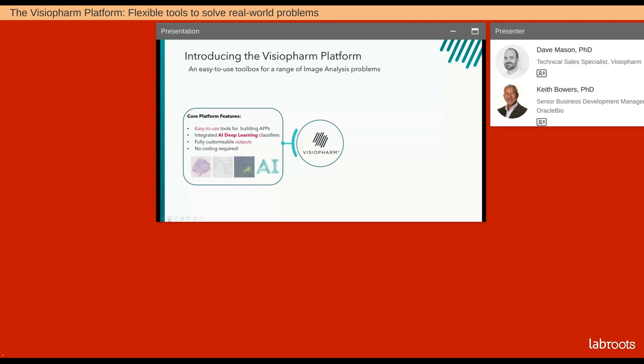It's very important to us that the outputs also be customizable. Every single question you ask of your data will require different metrics. Another pillar that the VisioPharm software is built on is that there'll be no coding required, and this makes it really easy for users to come in and start building apps to solve problems with very little lead time. We also accept a wide range of modalities using the core tools — H&E, IHC Brightfield, as well as fluorescence and some more exotic file types.